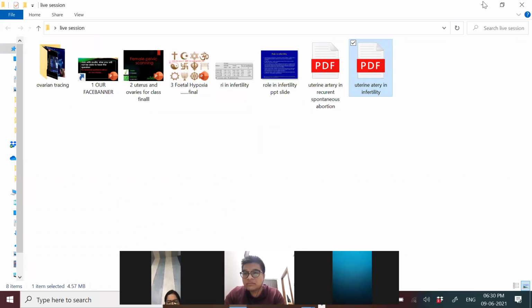But I will give you a very short reply. Pulsatile index is nothing but what I gave in my explanation. This RI, PI is nothing but the ratio between the systole and diastole, calculated in a formula. Now, what is the formula? That is very lengthy, which will take about 1 hour, which is in detail in our courses.